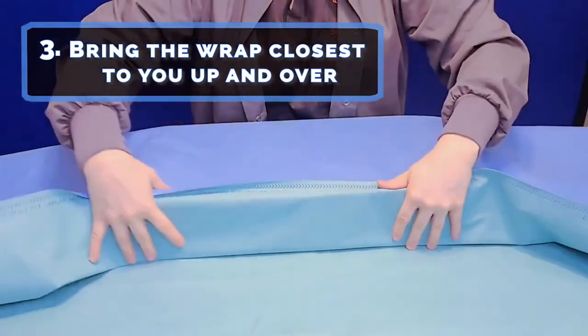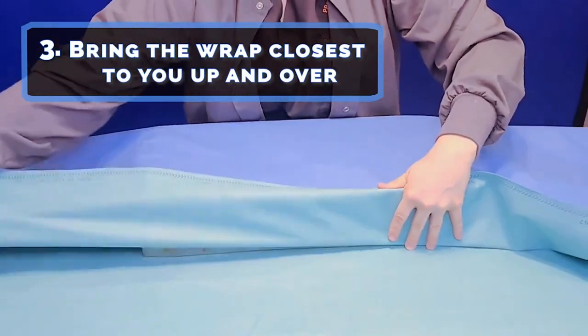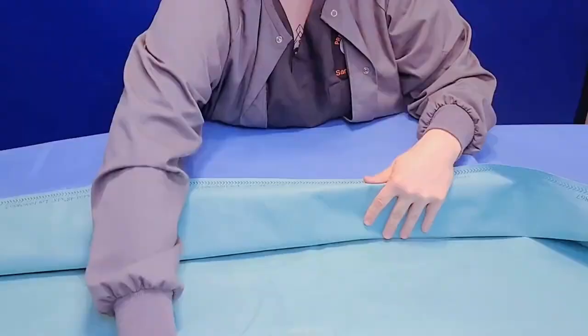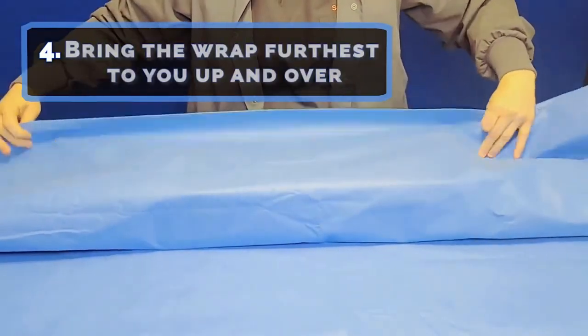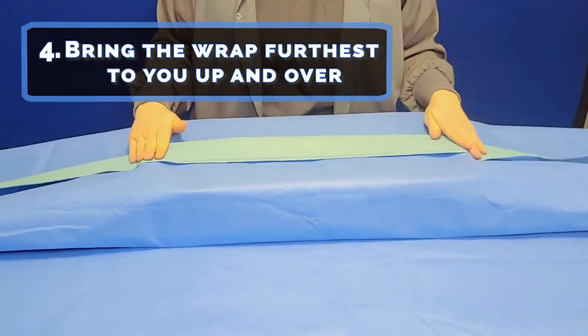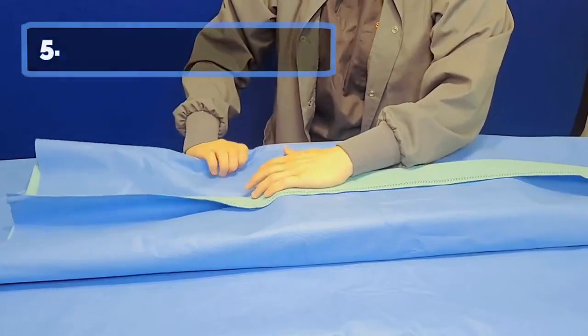Step four: bring the wrap furthest from you up and over towards you, leaving a tab. Step five: bring your sides up by slightly tapering both corners — it will look like your side piece is in the shape of a triangle.